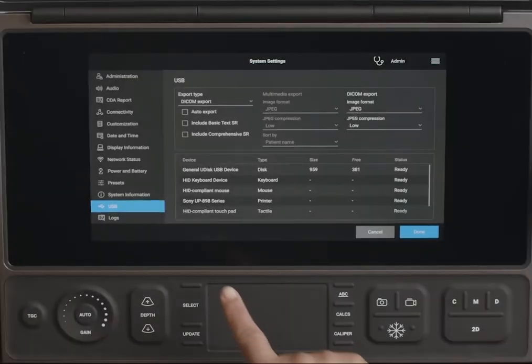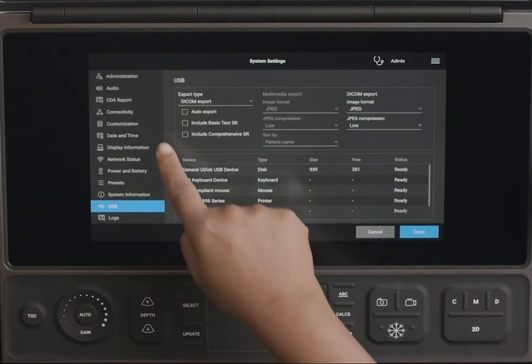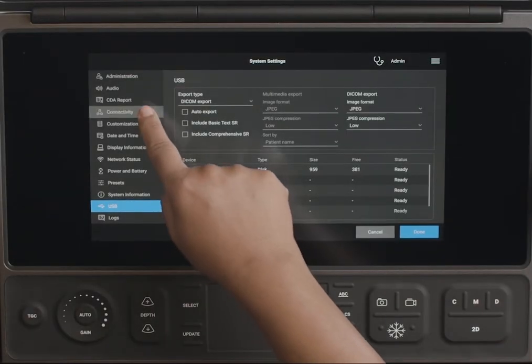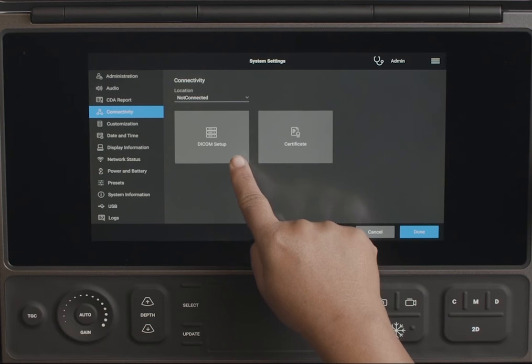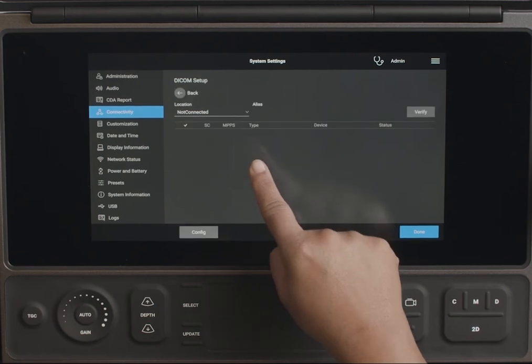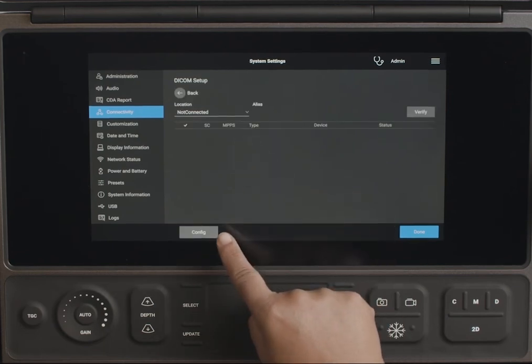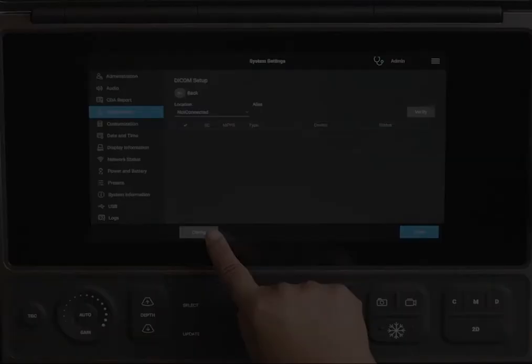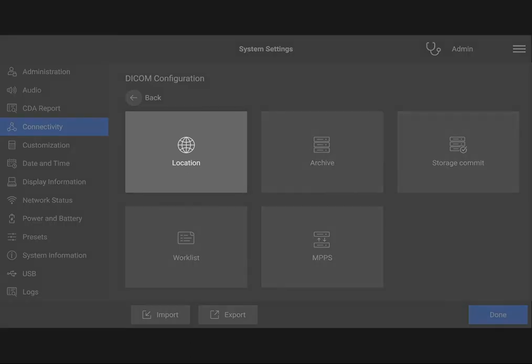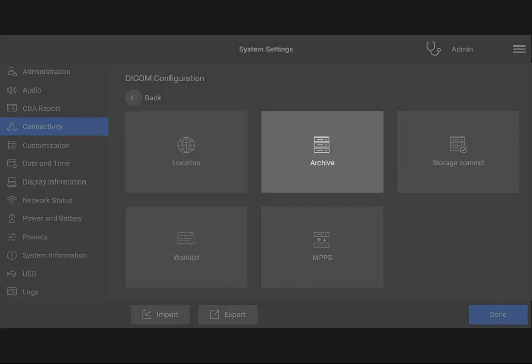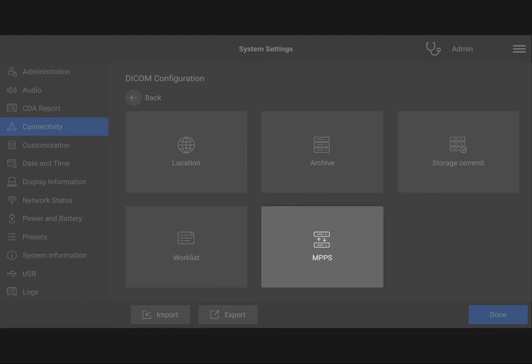Now, you will need to configure your DICOM preferences on the Connectivity Settings page and start configuring your DICOM connection. On the DICOM configuration page, you can set up your system's location and connections to a worklist, archive, storage commit, and MPPS servers.